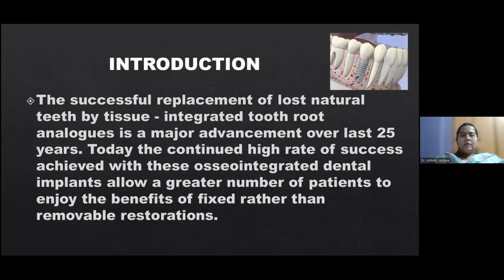Introduction. The successful replacement of lost natural teeth by tissue integrated tooth root analogs, as seen in this picture. So this is the implant, and that is the tooth root analog. It is a major advancement over the last 25 years.